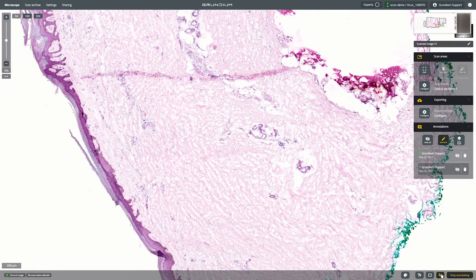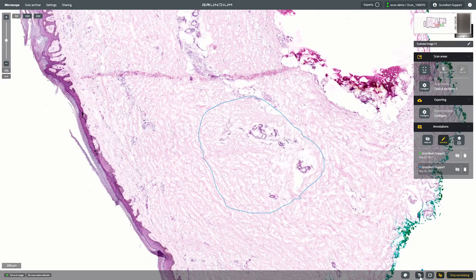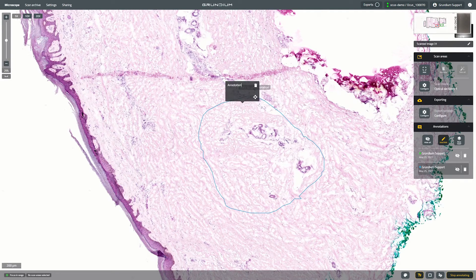The Freehand tool lets you mark very specific areas of interest. To change the colour of your layer, click on the colour palette icon.